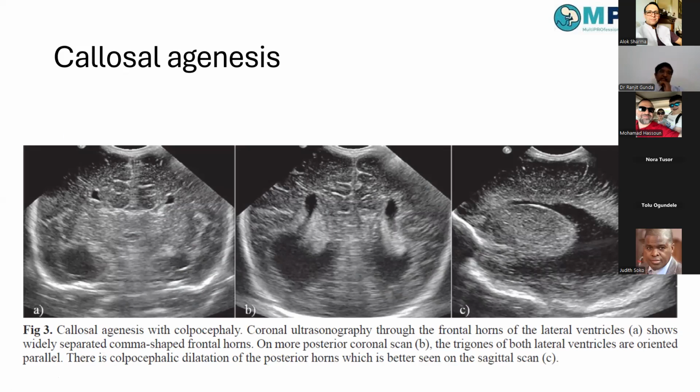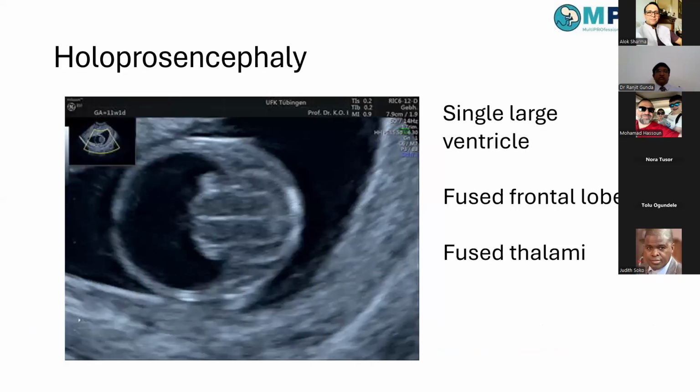Isolated absent corpus callosum, or isolated absent septum pellucidum, might not have long-term implications. It generally doesn't warrant further neuroimaging if the baby is otherwise clinically well. But we need to be sure that there are no other associated congenital cerebral anomalies. Next, let's go into common associations with ventriculomegaly, holoprosencephaly.